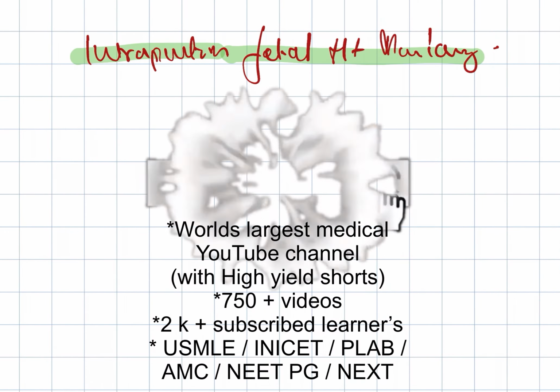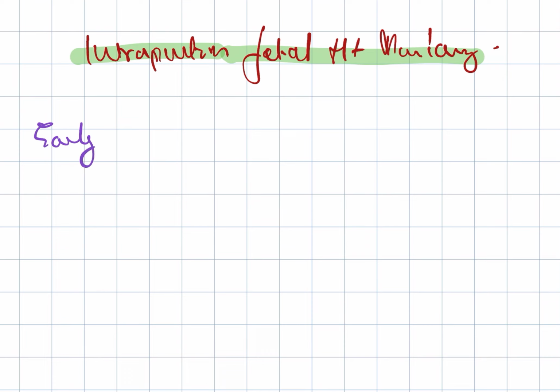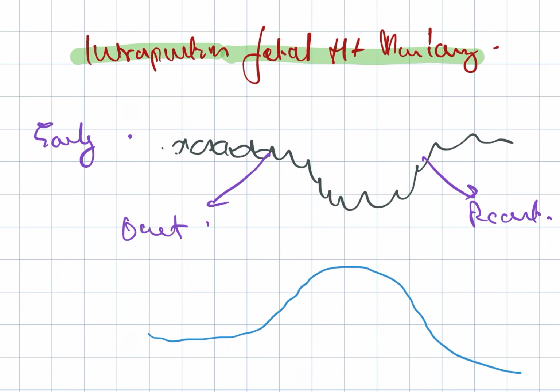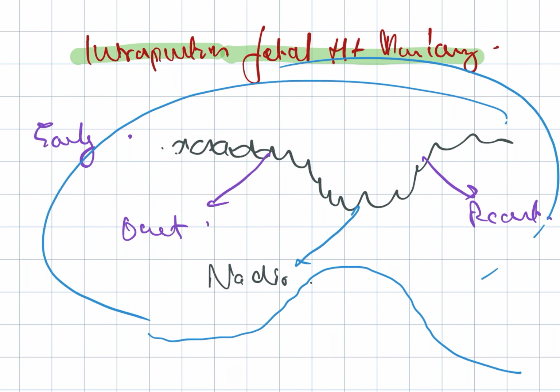Intrapartum fetal heart monitoring. So firstly, there's the early stage. Before this, we need to know as a graph. This phase is nothing but the onset. This is the recovery. Below, looking at the contractions. This point is the nadir. Keeping this picture in mind, we're going to go further with the explanation.